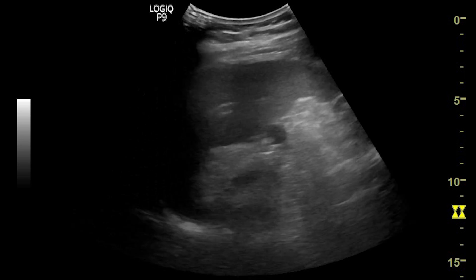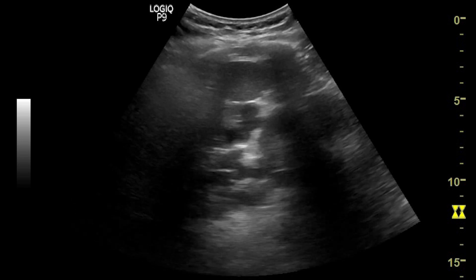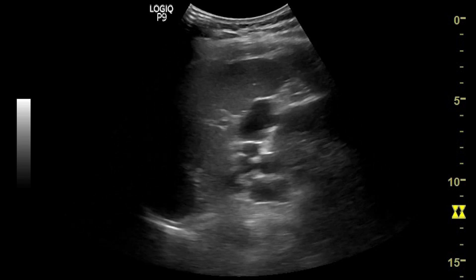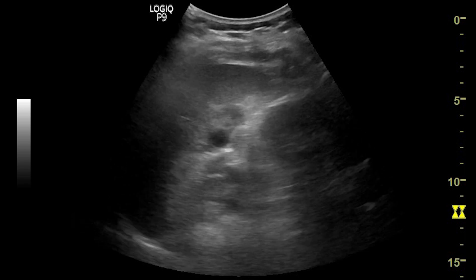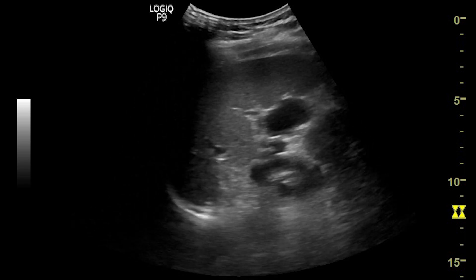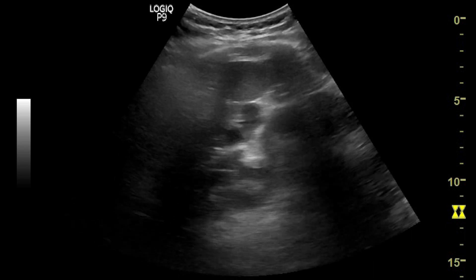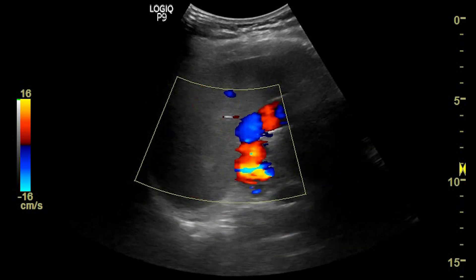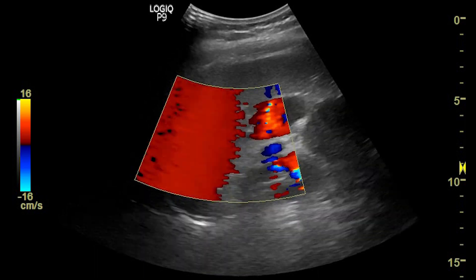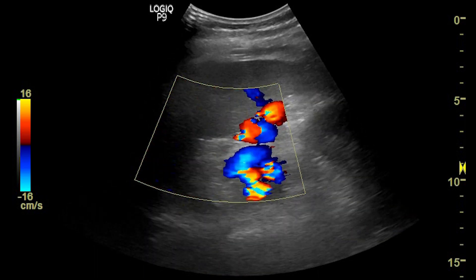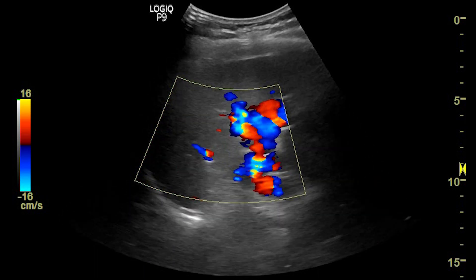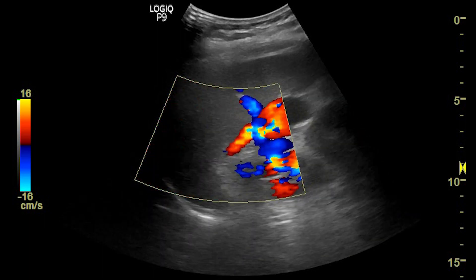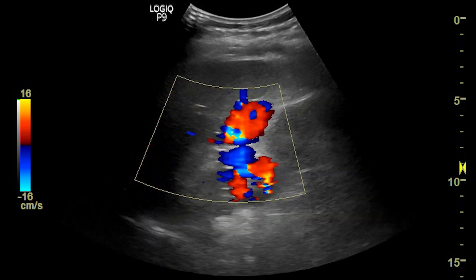Here on real-time you can see the mildly enlarged spleen. Multiple anechoic cystic areas are noted at the splenic hilar region. With color Doppler, you can see the flow within these tortuous cystic structures, indicating the splenic varices.